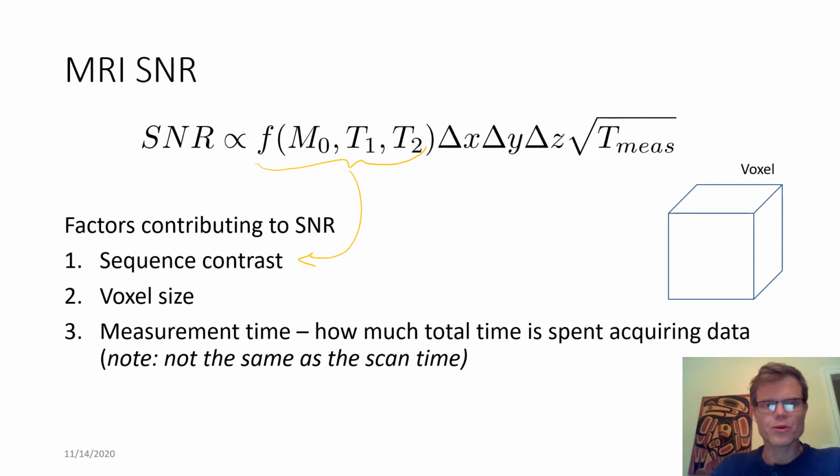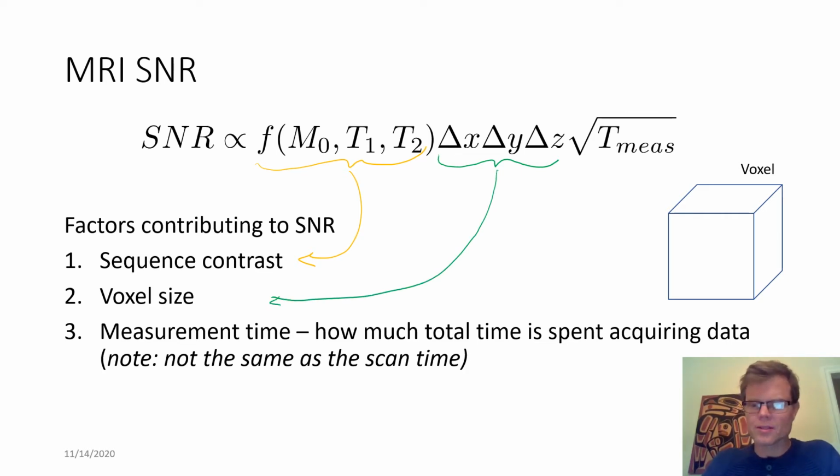Then the two other important terms that we're adding here, one is the voxel size. So that, these are these three terms here. Making that explicit here, our spatial resolution in X and Y, and our spatial resolution, sometimes this is our slice thickness, in the third dimension. And you see here we're actually looking at a voxel volume, the product of all three of these.